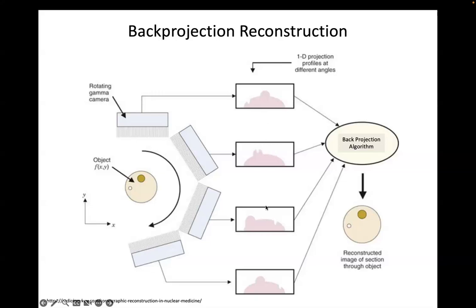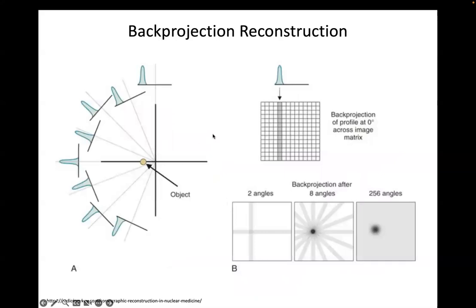And so this set of projections is what we're going to use the back projection algorithm on to reconstruct the image itself. And that reconstruction is done pretty well exactly the same, using the same principles that computed tomography uses. And if you look at just naive back projection, if I have a dot of activity in my scanner, on my detector, when I look along my detector, it maps to some blob, like a Gaussian blob with a full width at half max of my spatial resolution.